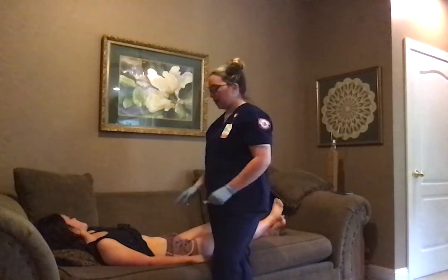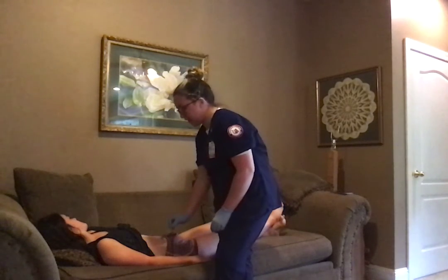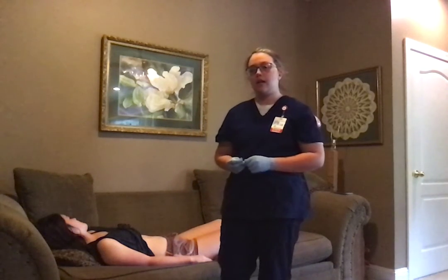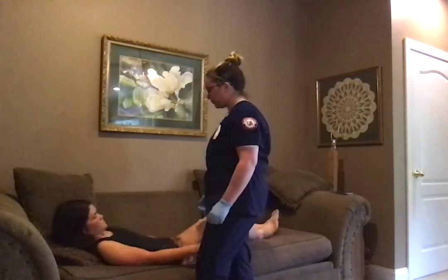So this is a subcutaneous injection site. So I would either give the injection at a 45 or 90-degree angle here, depending on the amount of subcutaneous tissue present and also the length of my needle. So you turn towards me.